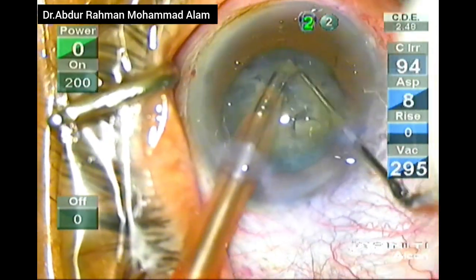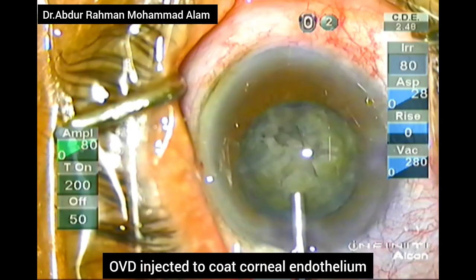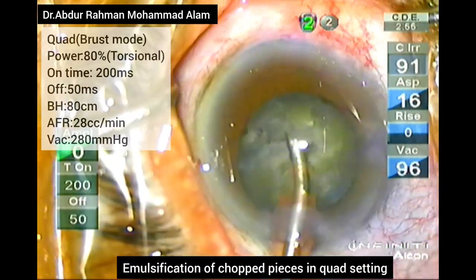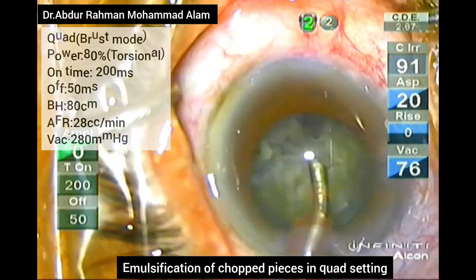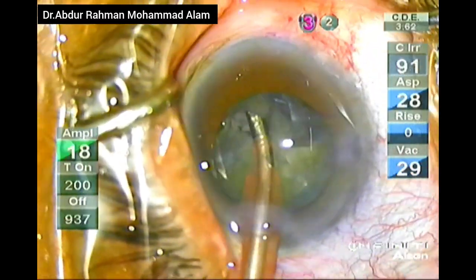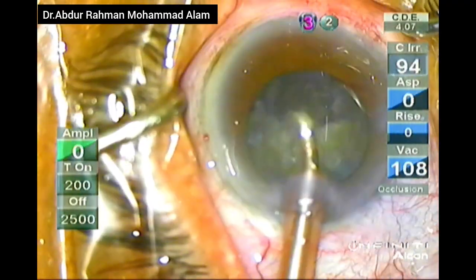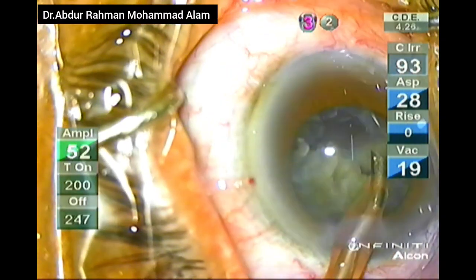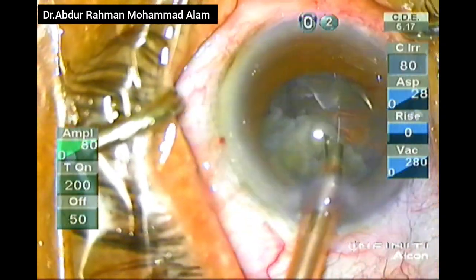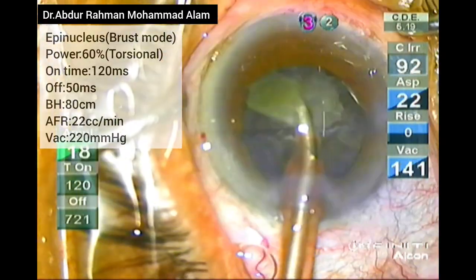This is a comparatively soft nucleus of grade 2. OVD is again injected to protect the endothelium before starting removal of the pieces by phacoemulsification. I am not introducing a second instrument through the side port because it can lead to leakage and shallowing of the AC. With the phaco tip, you can easily rotate the nuclear piece to your desired location to be phacoemulsified.